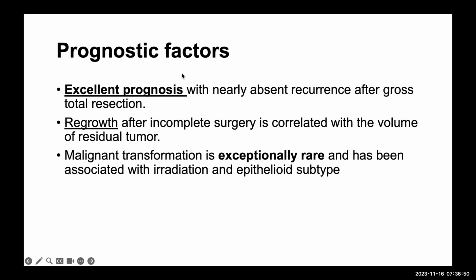I'm reporting to you my morphological observations, but to make it more objective, I could simply do an S100, a SOX10, CD56, collagen type 4. All 4 should be positive in a schwannoma, and more or less none of them should be positive in a renal cell carcinoma. And renal cell carcinoma has other specific markers. So we can always objectify the morphological impression if there is a clinical suspicion to go further. And I think you should not hesitate to do that in those situations for the future.